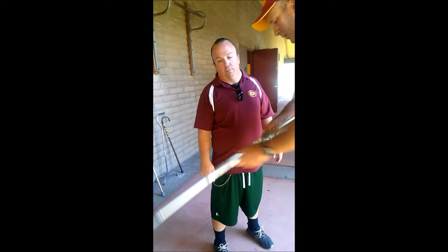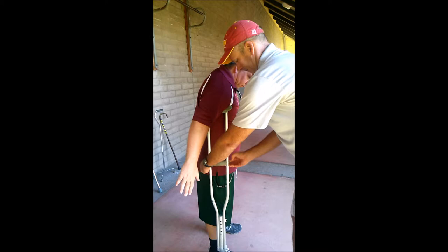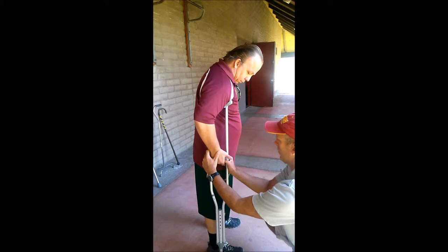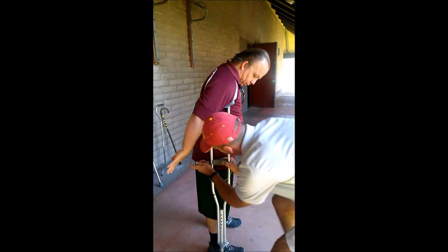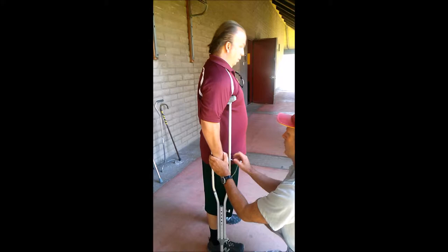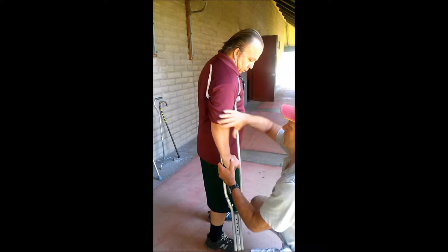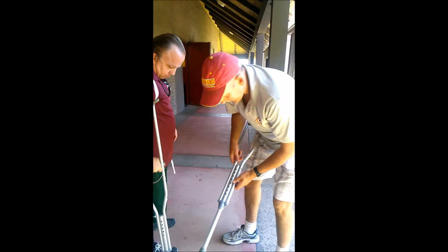Let's bring it down one notch and see what that looks like. John, how does that feel? Good. The crutches give you lateral support, so you're kind of off to the side a little bit. You're not resting your armpit down - you're using your tricep muscle to stay taller. I'm going to adjust the other one so that it's the same height.